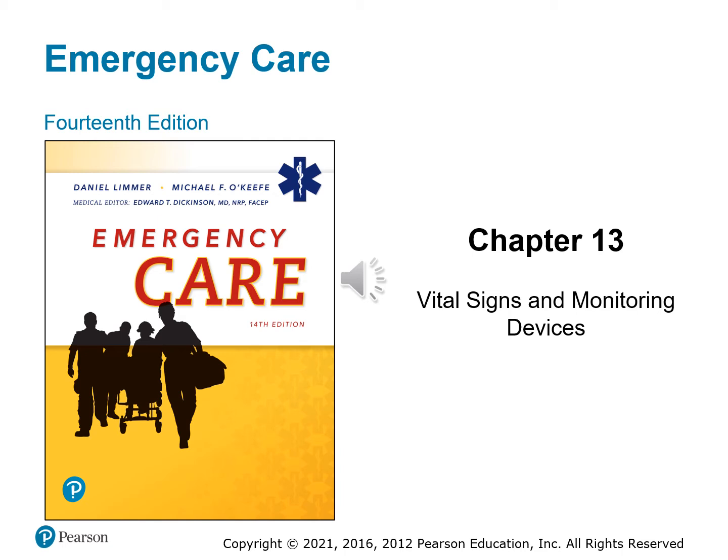Vital signs and these monitoring devices are very important in the assessment process. It's going to give you a baseline, that initial reading as to where the patient stands, whether that's normal or not normal. It's going to set that benchmark for either you want the patient to try to get back to normal while they're in your care, or you want to maintain them in normal, but you're monitoring for them to look outside of that normal range.